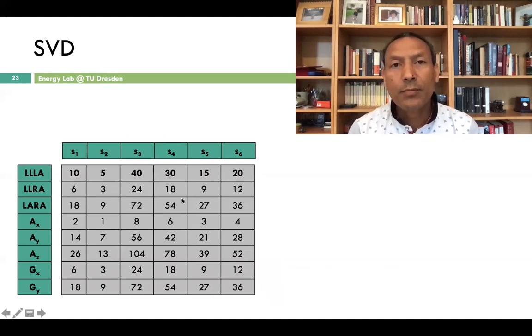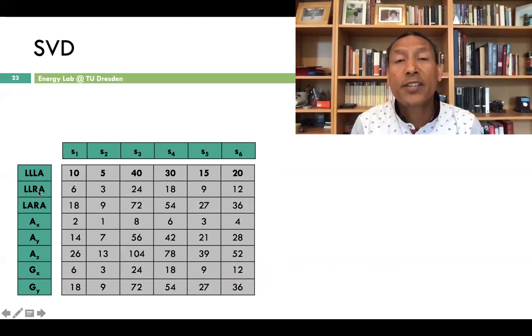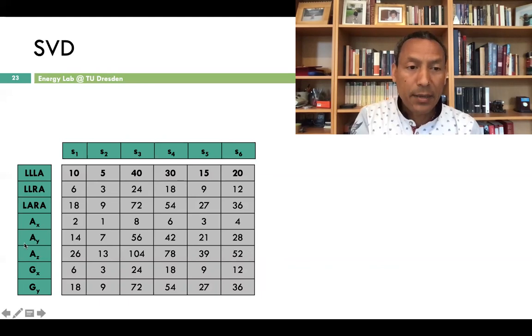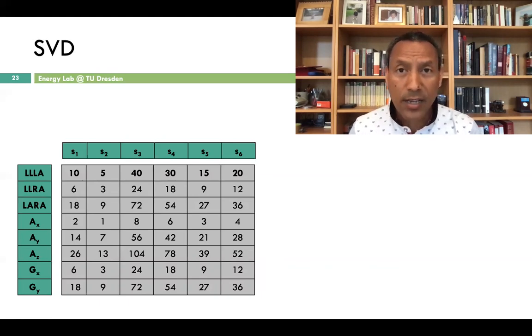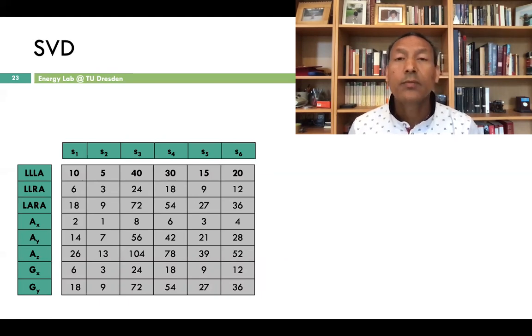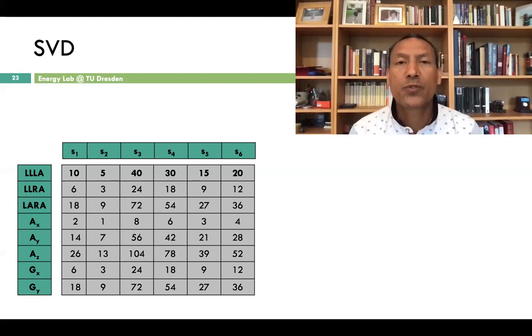Now look, the three ECG channels here should observe one and the same thing, which is the ECG. The motion sensors here may observe both the ECG activity, the activity of the heart as it pumps, and the exertion, the movement of the body when the person moves.